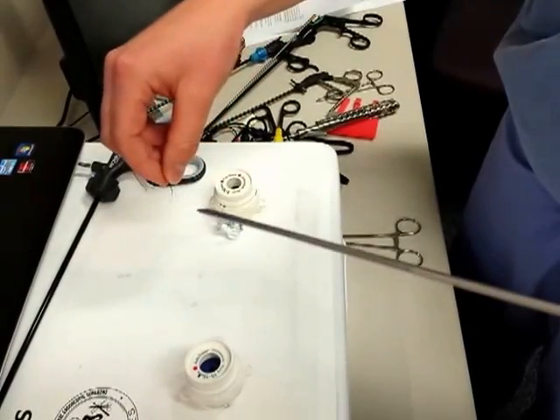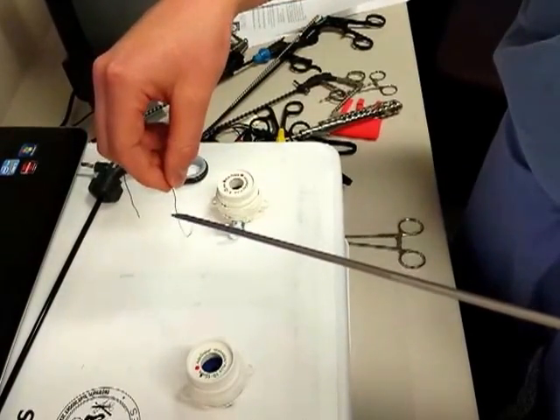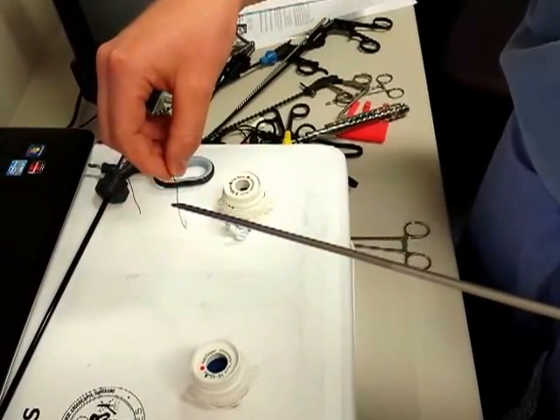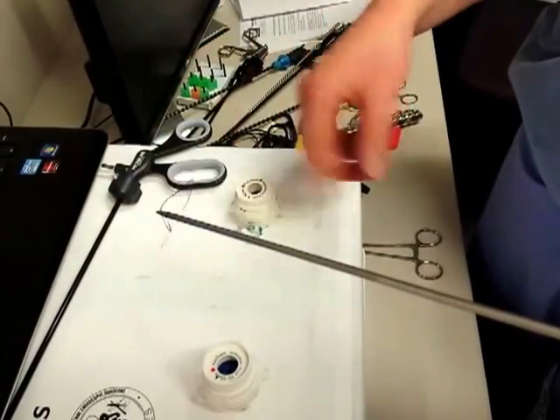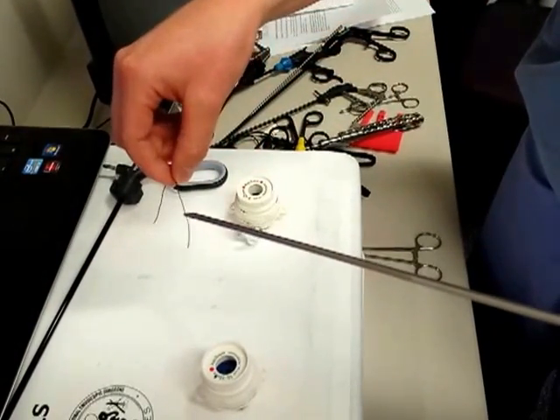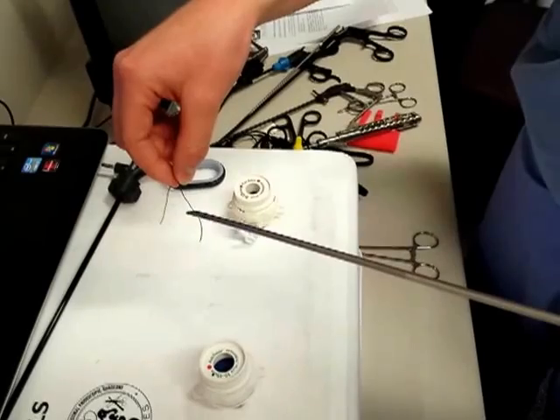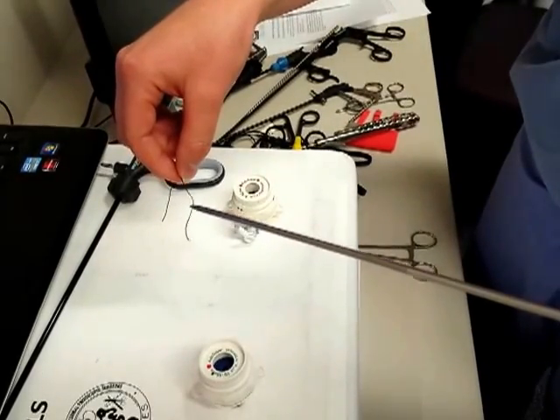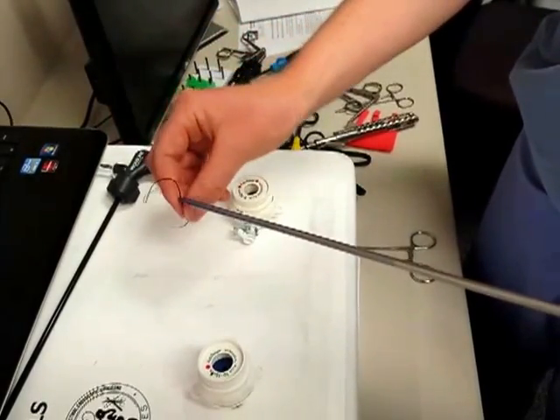If you do not take advantage of this, you may find the needle pointed in an opposite direction or in a direction that is not helpful once it is in the box, and it will be more difficult to set it into the needle driver of the dominant hand once it is introduced into the box.